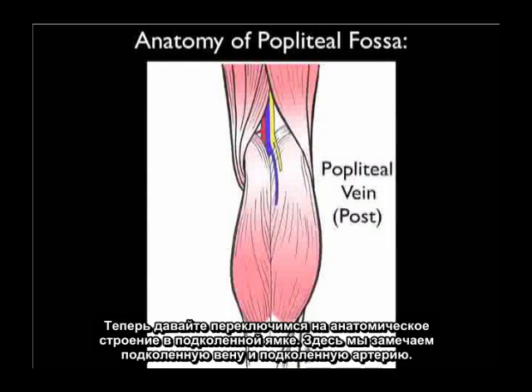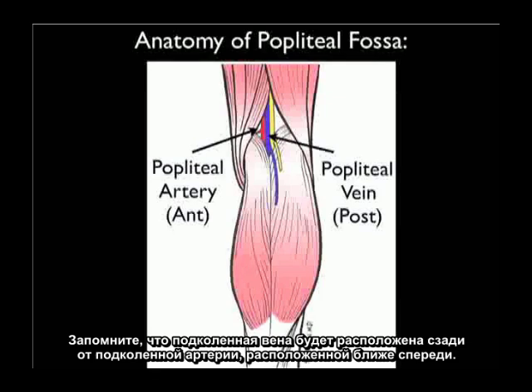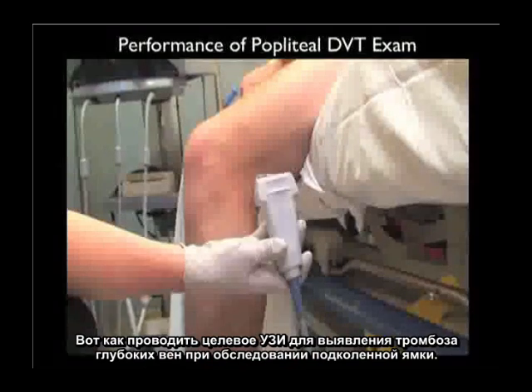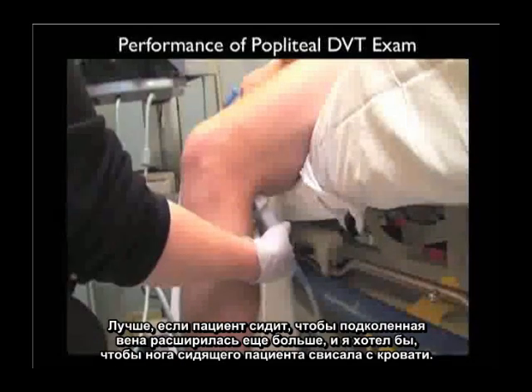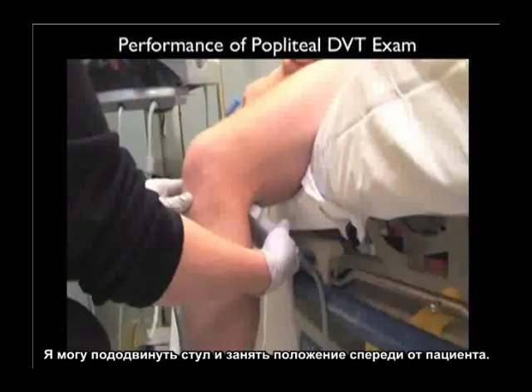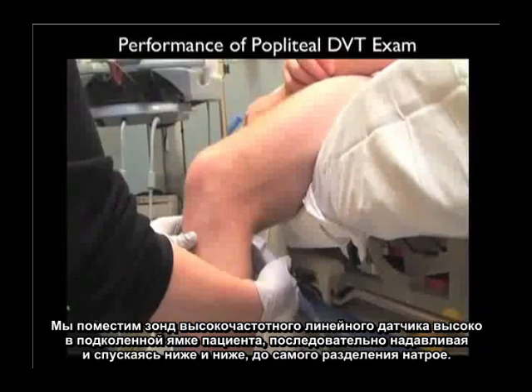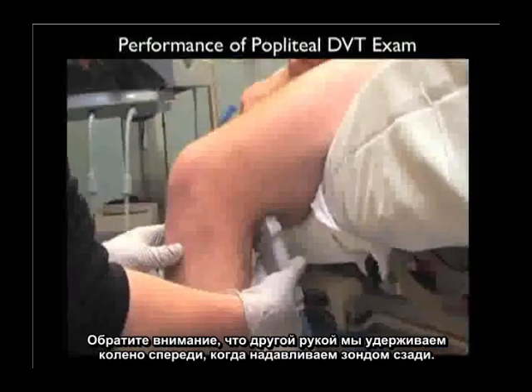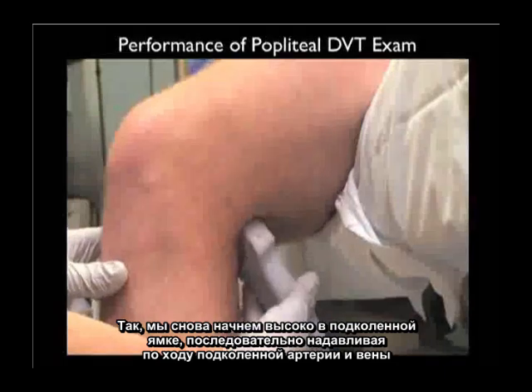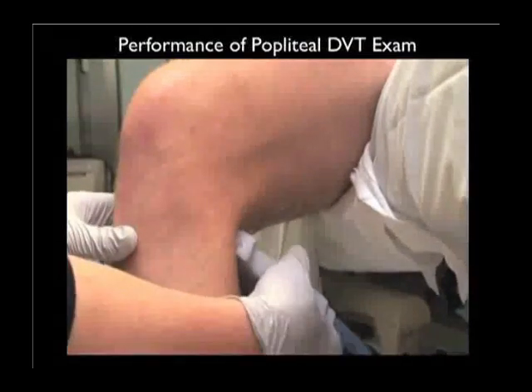Now let's turn to the anatomy of the popliteal fossa. We note the popliteal vein and popliteal artery, with the popliteal vein in an orientation located more posterior to the popliteal artery, which is more anterior. To perform the focused DVT exam in the popliteal fossa, it's best to have the patient sitting up with the leg dangling over the bed. We place the high-frequency linear array probe high within the popliteal fossa, sequentially compressing down to trifurcation, using the other hand to stabilize the anterior knee.